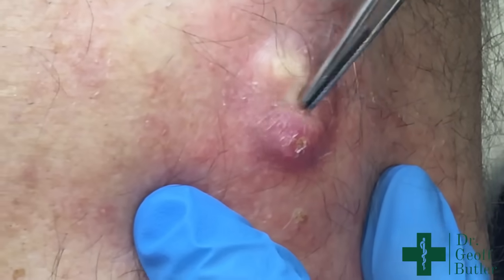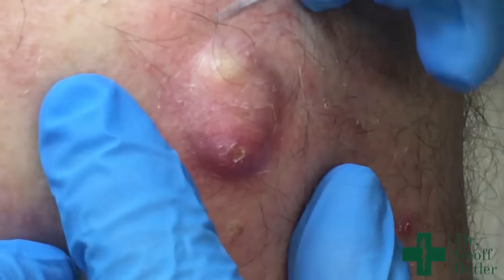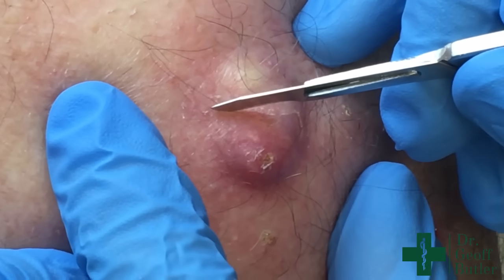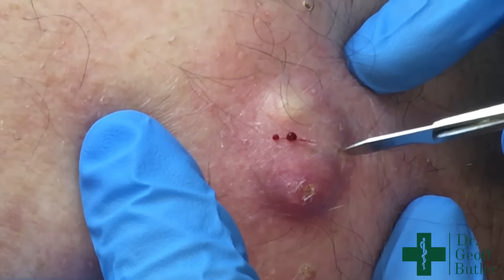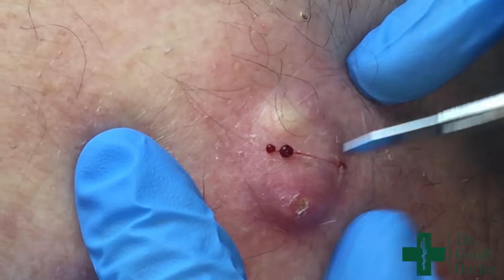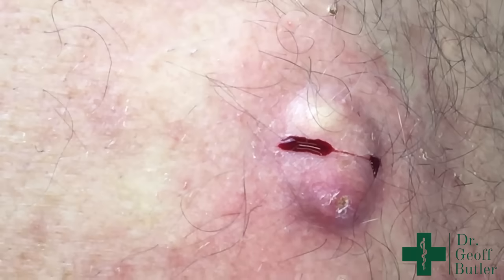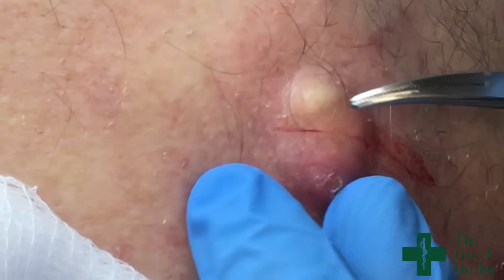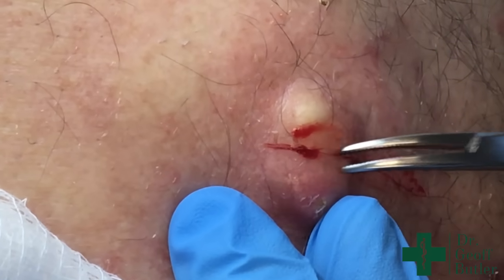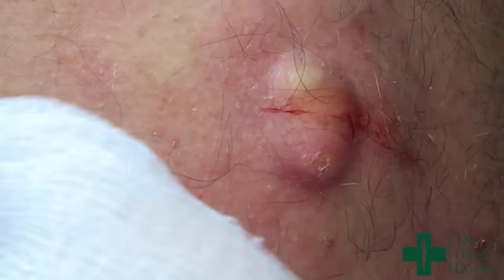No pain there at all. This is the number 15 blade. This is going to seem ridiculously superficial — that's done on purpose. Because if it's possible to salvage this membrane at all, we'll have to work very gently with it. But we're not deep enough for me to do much with that yet.